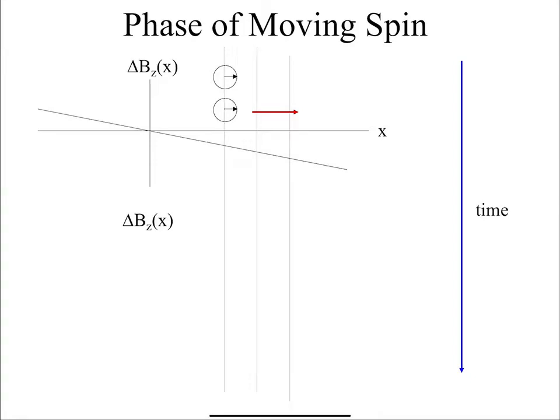Okay. And so the idea is MR is actually sensitive to flow, and a lot of MR is imaging of flow. And that's really important because in biological tissues, if things don't move, that's generally a sign that something's going wrong. So today we're going to spend the first half of the lecture talking about how we measure things that move and then get some more insight into the biological tissue.